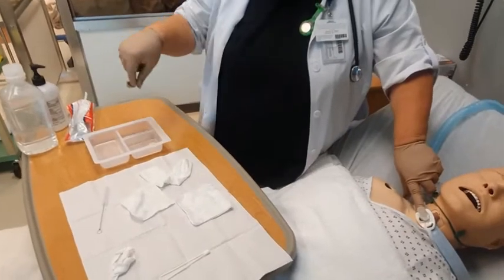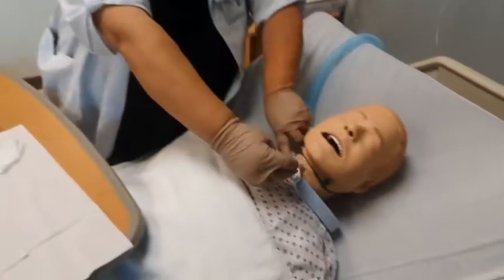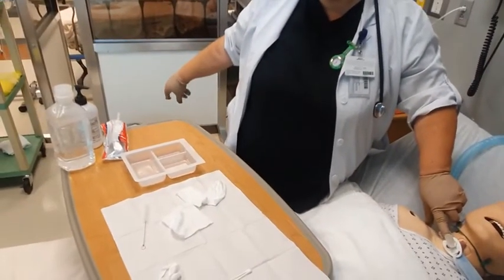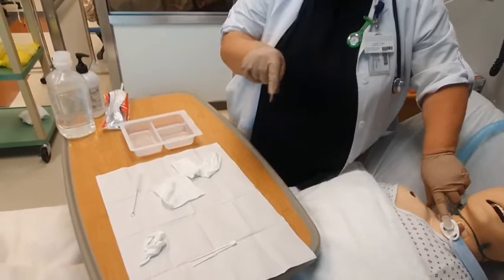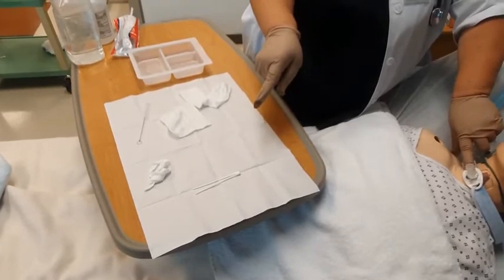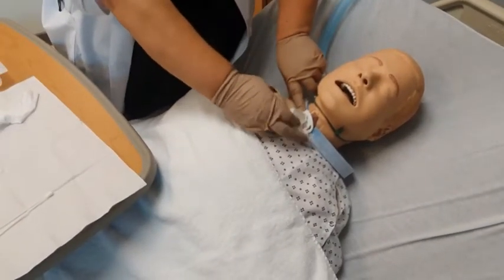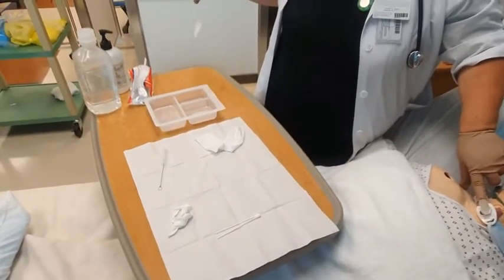So when you cross here, you can go around and you will do the pass once and dispose. The pass again over here and dispose. Okay, then, if there was a lot of nastiness on this white part right here, you could actually use the Q-tips to do that at this time. Just remember not to cross-contaminate when you're crossing over. But at this time, you'll take the gauze, you'll dab around it to make sure that you have gotten all the saline off of there, and then you will dispose of it. You notice that I am not dropping my hand below my waist.